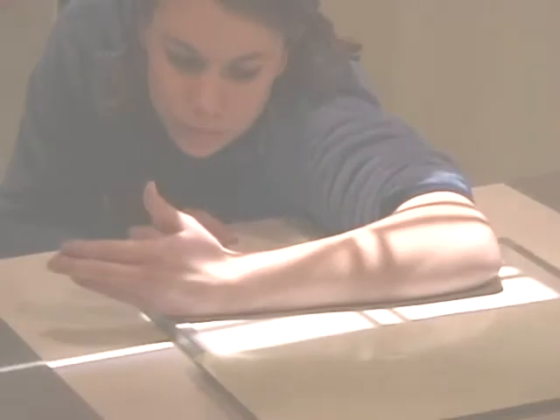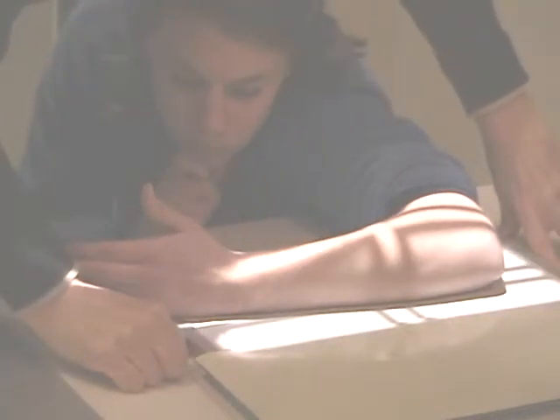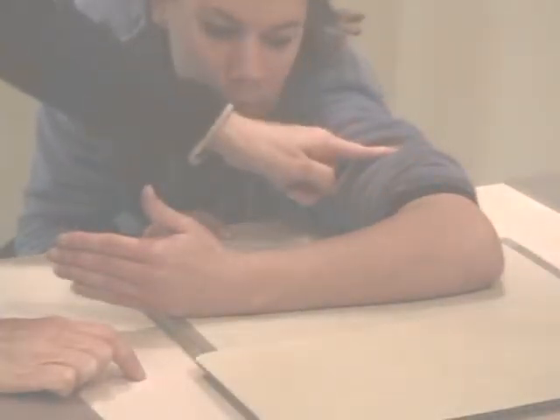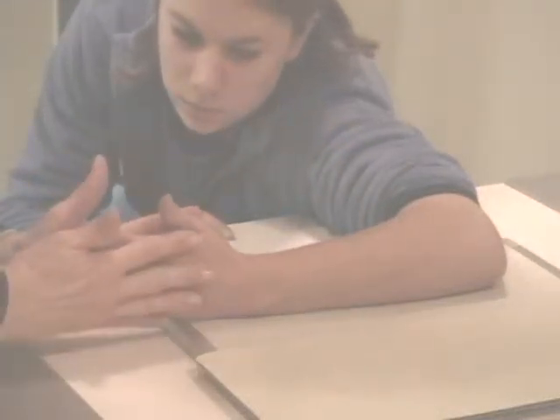Now I can fine-tune my collimated field and my centering. Baby shadow, evenly spaced. Baby light over the lead strip, and some collimated field here. This crosshair is coming right down the forearm with the humerus bent, coming off the film at a 90 degrees, and then I want her hand in a true lateral position.